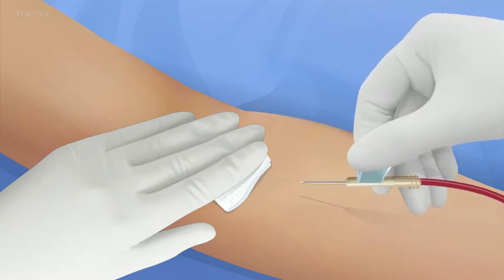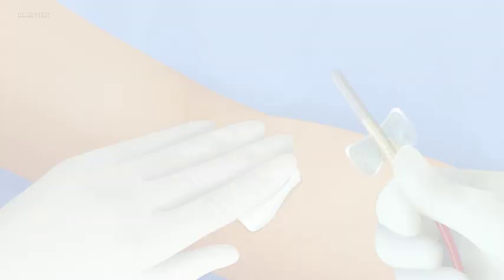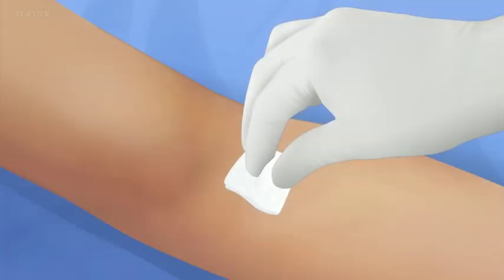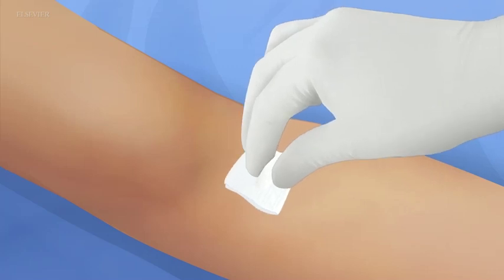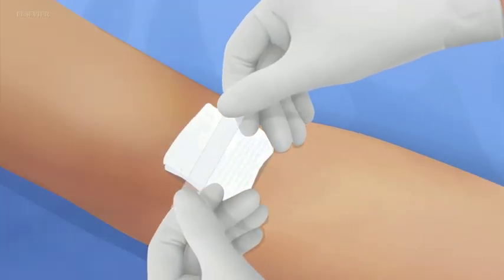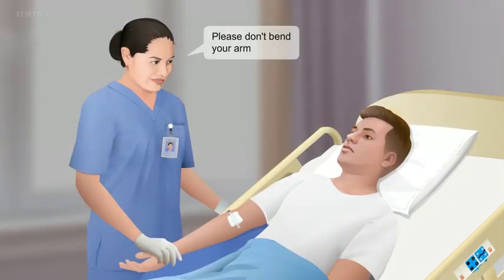Quickly but carefully withdraw the needle from the vein, activating the safety mechanism. Immediately apply pressure over the venipuncture site with gauze until bleeding stops. Observe the venipuncture site for bleeding for 5 to 10 seconds before applying a bandage. Use tape or a bandage to secure the gauze and allow it to remain in place for at least 15 minutes. Instruct the patient not to bend his or her arm.